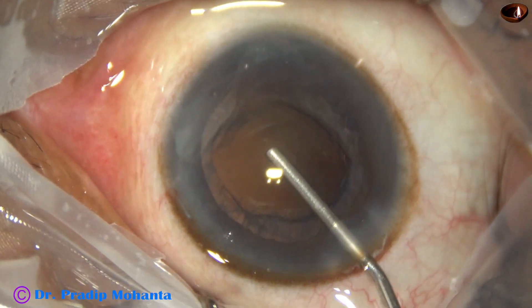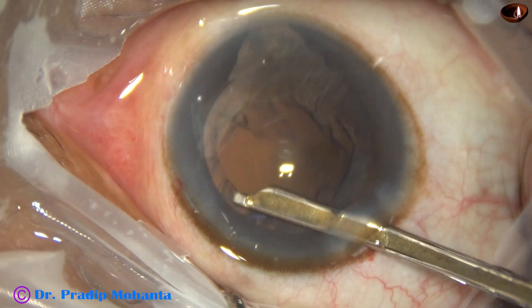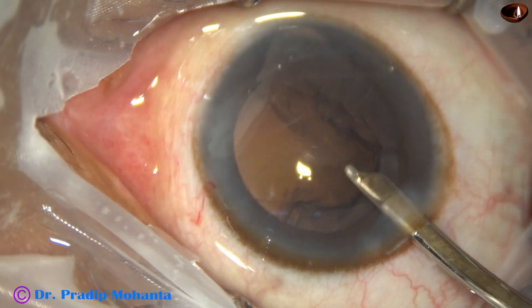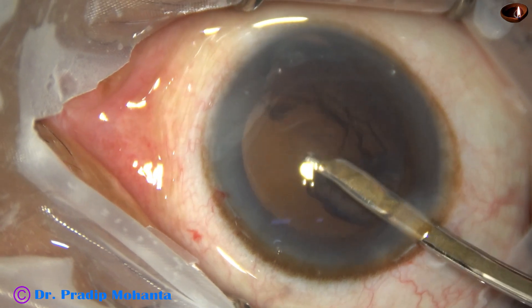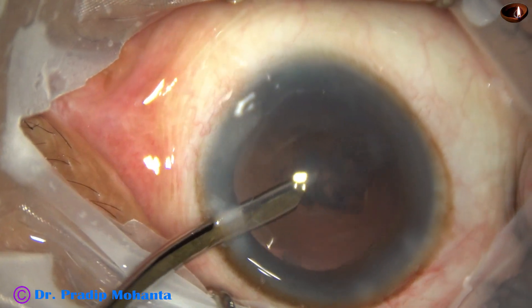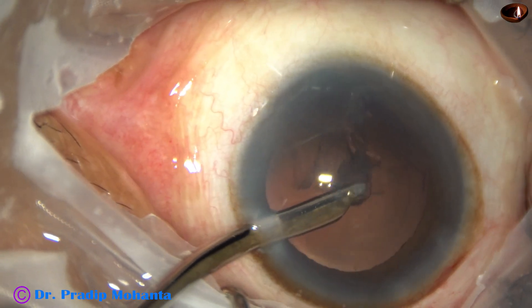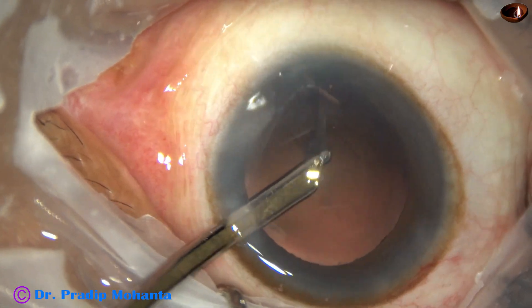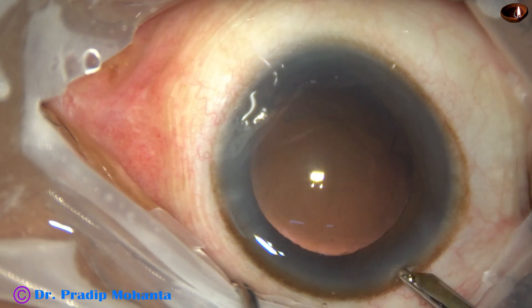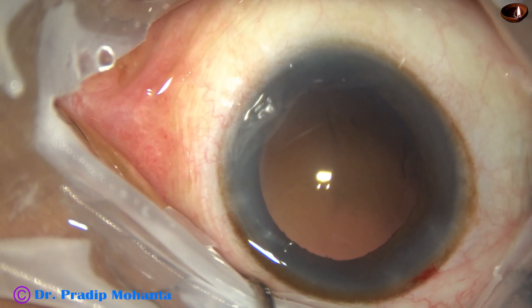In cases where the zonule is weak, I prefer a Simcoe cannula. Automated bimanual irrigation-aspiration or coaxial I/A can suddenly catch the posterior capsule and before I can react, there can be zonular dehiscence. With Simcoe, control is better — we can do it slowly, watch what is happening, and safely remove the cortex. I have made only one side port about 90 degrees away, which reduces some astigmatism induced by the main wound.